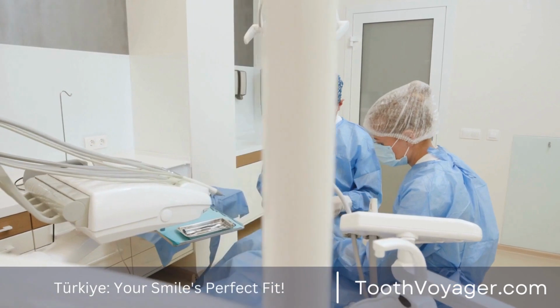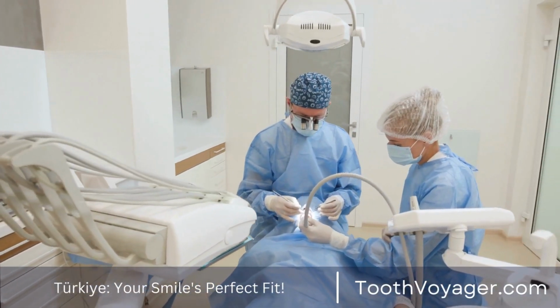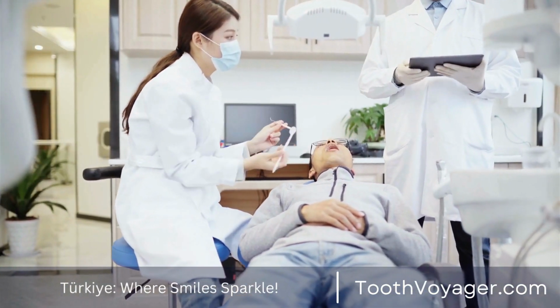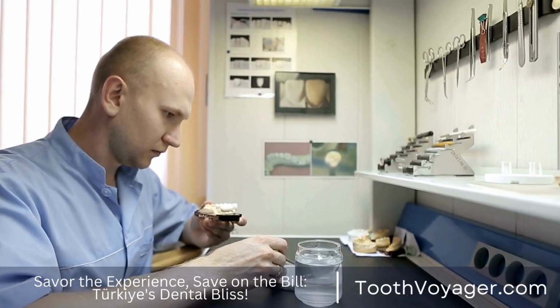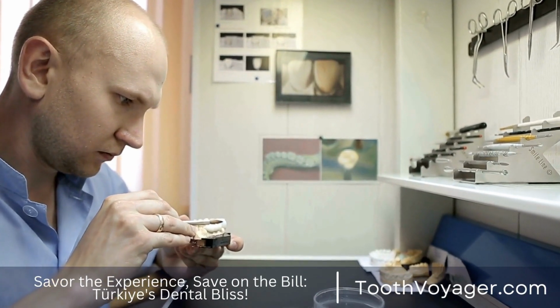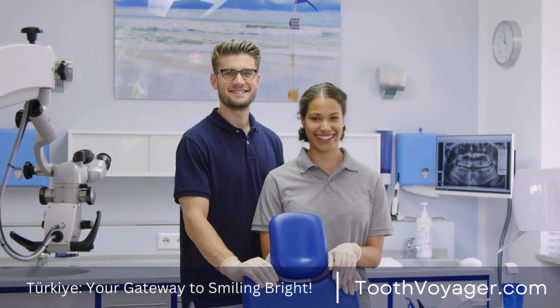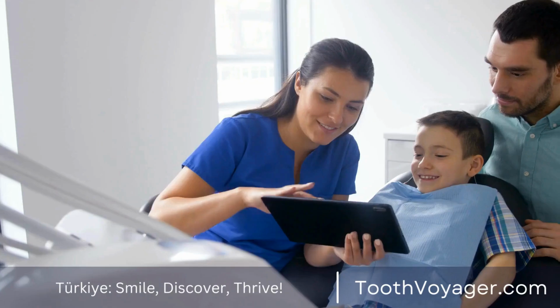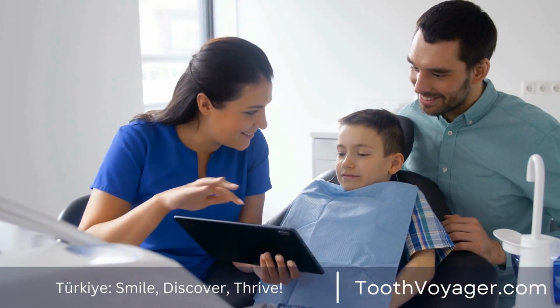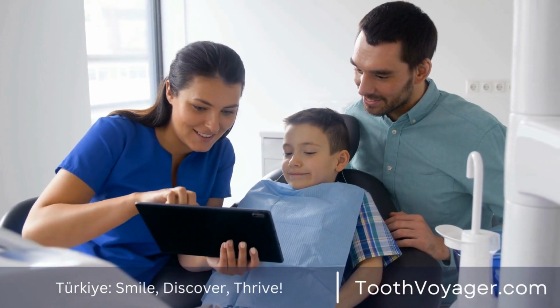The first step of creating custom dental crowns is to take exact impressions of the patient's teeth. These impressions are made into a mold of the patient's mouth that acts as a template for the customized crown. Dental technicians then meticulously form and size the crown, ensuring it is a perfect fit to the affected tooth. After that, the focus turns to the aesthetic aspects of the crown. By combining shades and mixing colors, the technician will match the shade of the crown to the patient's natural teeth to ensure the crown is seamless and nearly indistinguishable from the adjacent teeth.